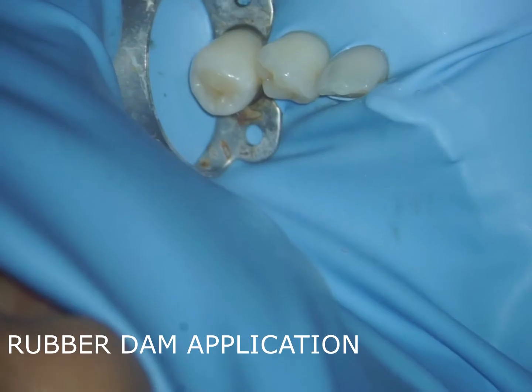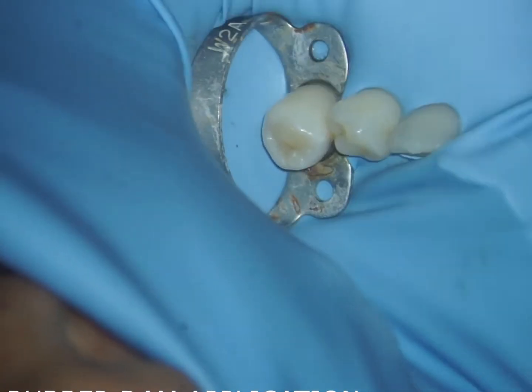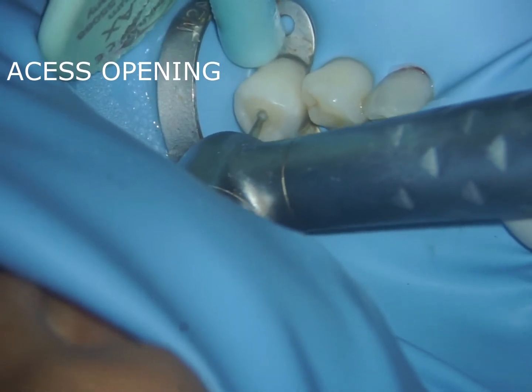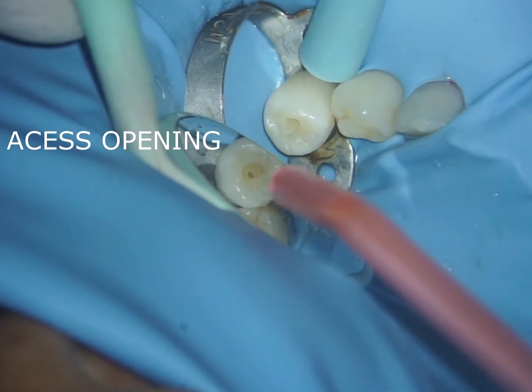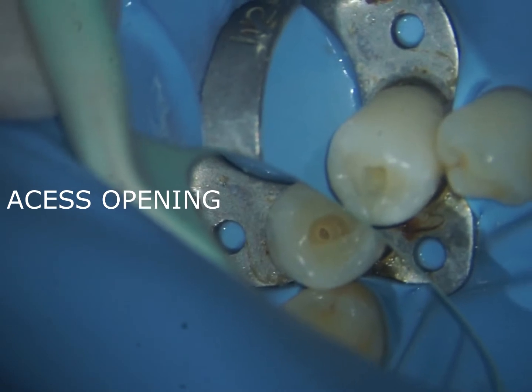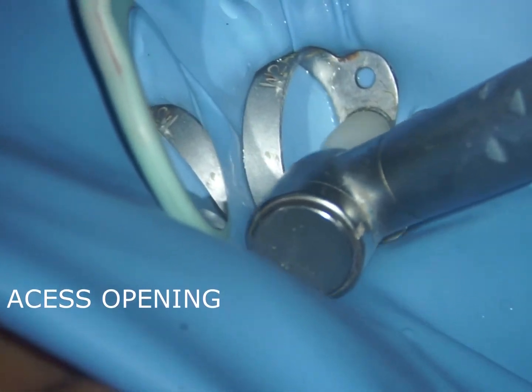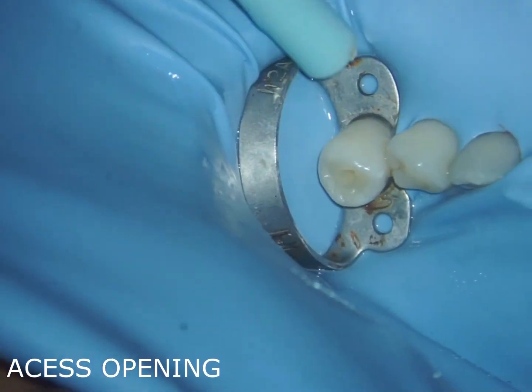After anesthesia and rubber dam application, it's time to start the access opening. We'll be using a round bur initially. Since it's a lower premolar, there's no furcation, so instead of the traditional technique of feeling the drop, we always prefer visualizing things. Here you can see that the roof of the pulp chamber has been breached — we can see the small hole. Since the tooth is non-vital, we do not see any bleeding from the root canal space.